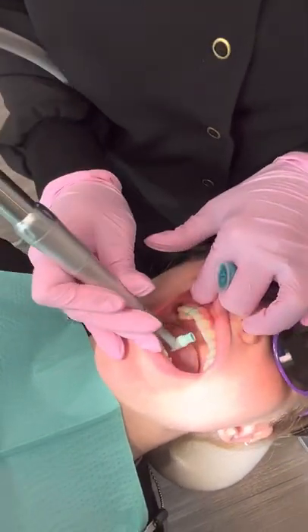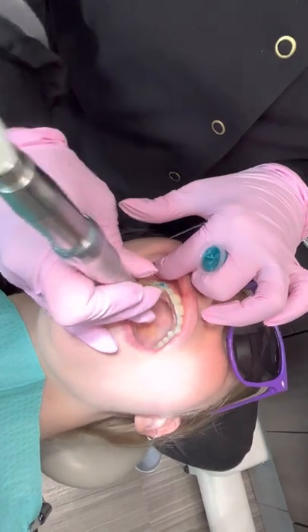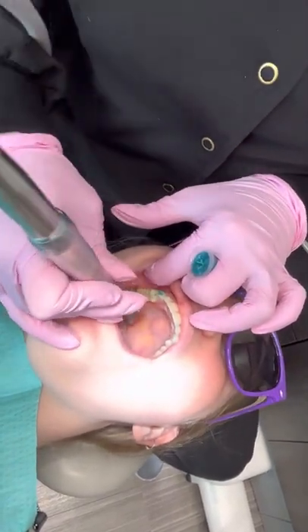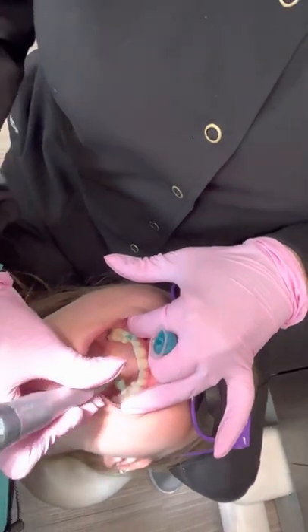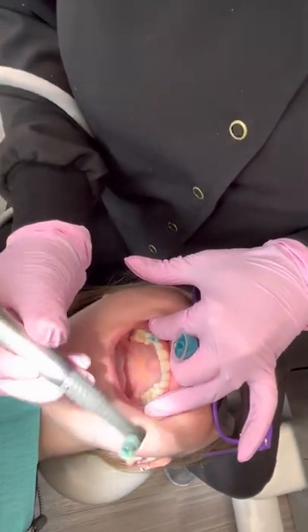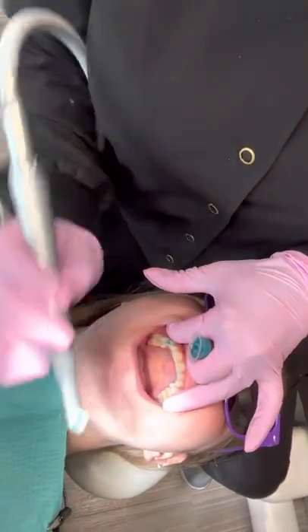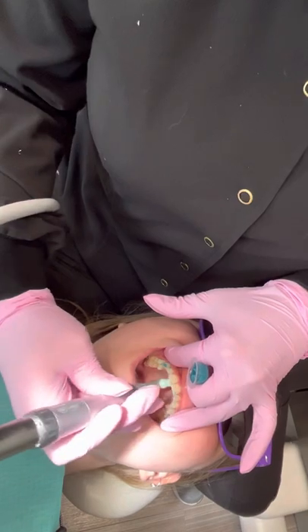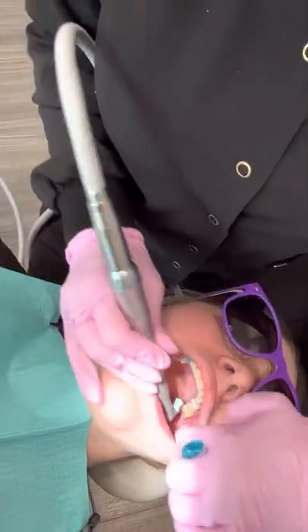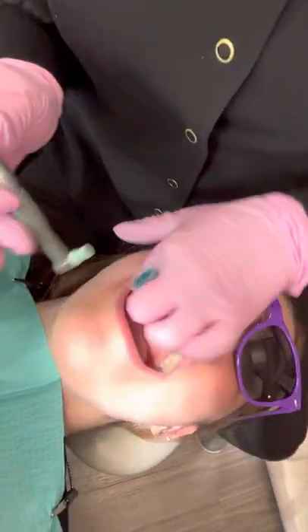Now we're going to go to the lingual surfaces, making sure we're always retracting the cheek. Then the other side, doing a swirling motion — I'm never doing a back-and-forth, only moving this portion here. Then go ahead and do the occlusals, making sure you go up on each of the cusps.